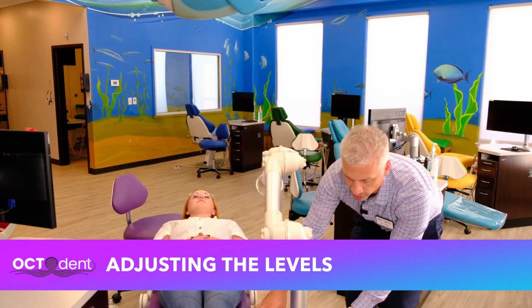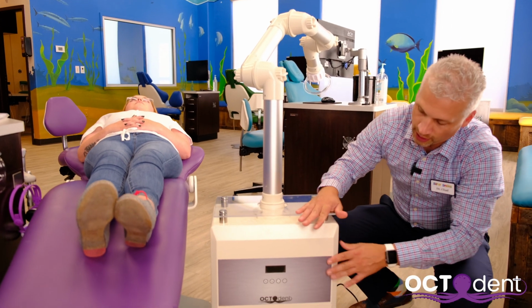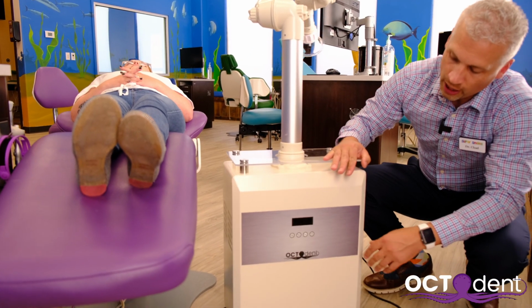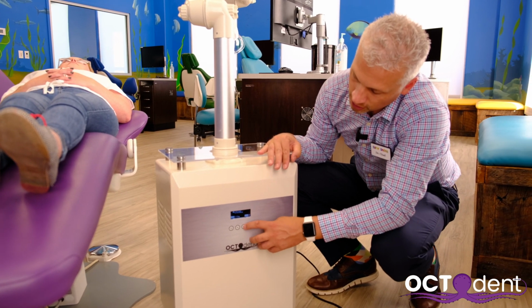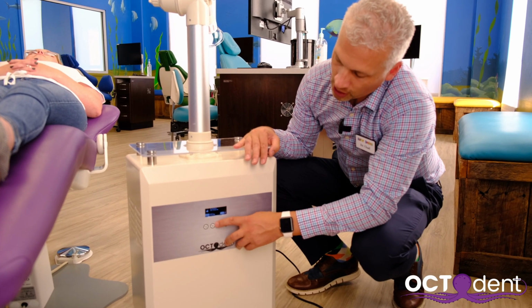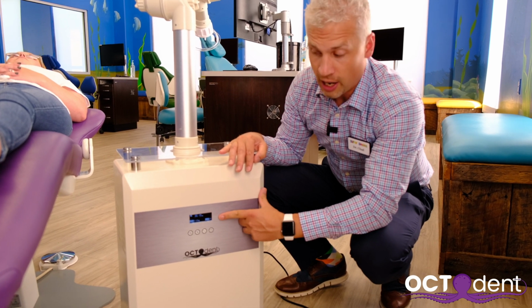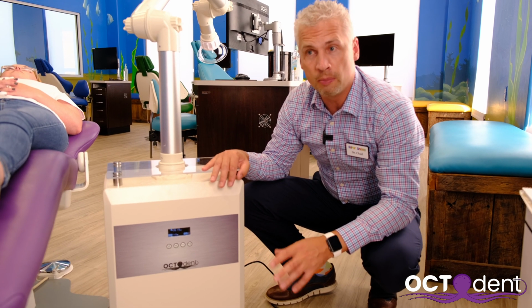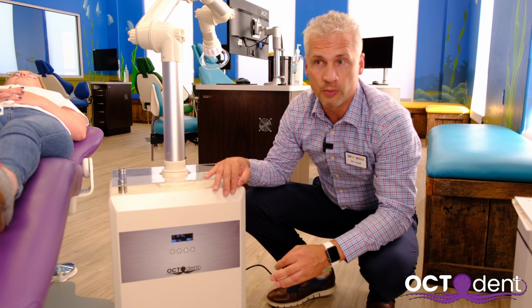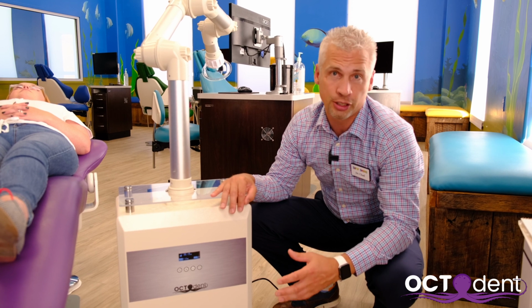Now, as far as the volume levels and the power of the unit, we have 10 levels on the unit. Generally, I'll use somewhere between 4 and 7. The reason I've chosen those is because I'm mostly concerned about making sure I'm capturing all of the aerosols, but I don't feel like I need to use 10 every single time.